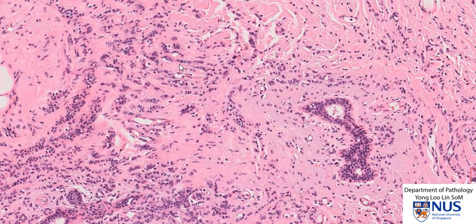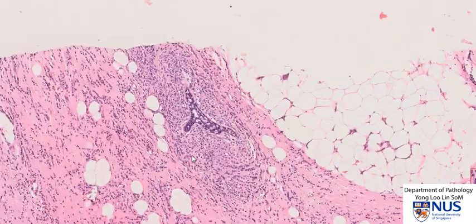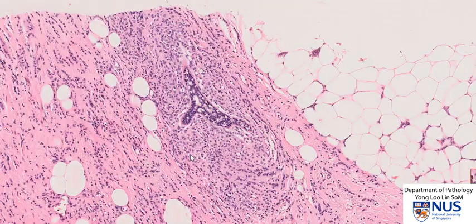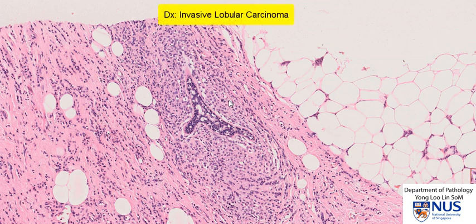Over here, we can see a very clear arrangement in cords or single file rows, and in this area it almost appears that the tumor cells are sort of surrounding this benign ductal structure. They're arranged almost in concentric rings around this benign structure. This is very classical for invasive lobular carcinoma.